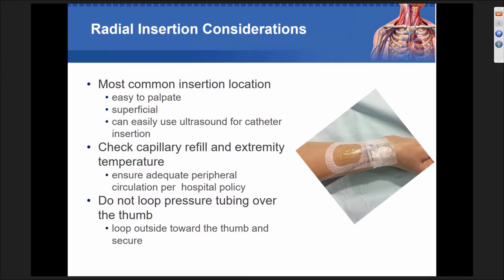I know a lot of you are like, I don't need ultrasound. I could feel the pulse. I've never needed ultrasound. But I want you to take it a step further. I want you to be a better vascular access specialist, respiratory therapist, or nurse, and think about the assessment opportunity that you can have using an ultrasound and visualizing what you're doing during that insertion.